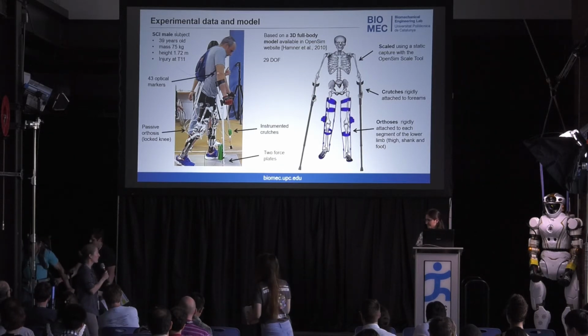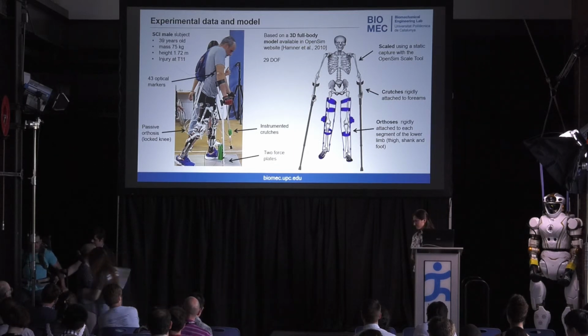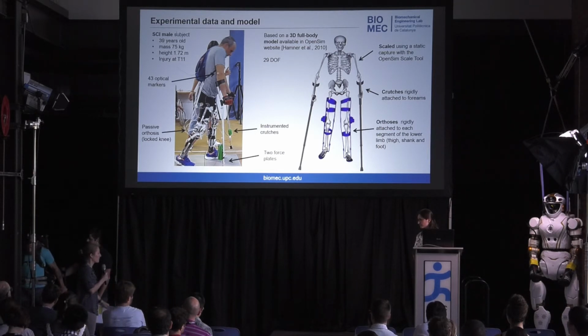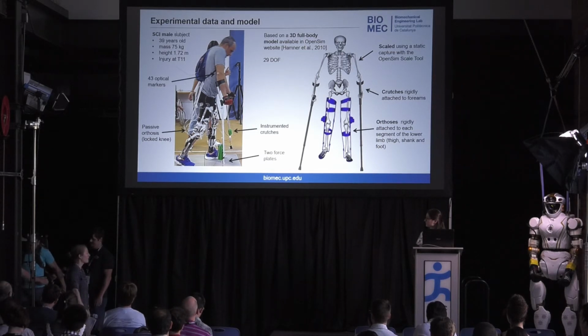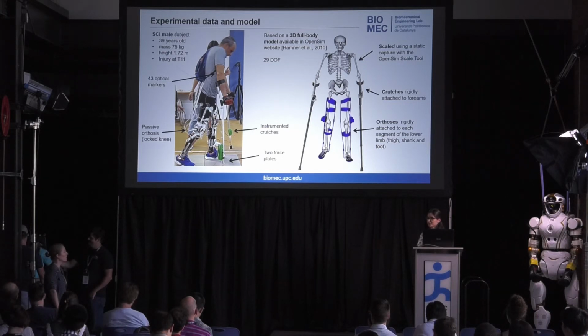So really briefly and at a high level, would you mind talking us through the advantages of going about this optimization in a simulation setting versus having a session and working with the subjects experimentally? Yeah, so for the patient, when we are using the trial and error approach with the engineer or the doctor modifying these parameter values, it's an exhausting process.